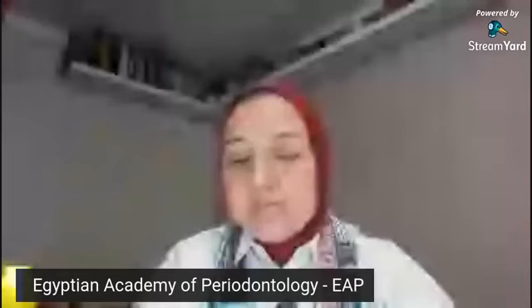So what we were saying is that after the frenotomy or the frenulum relocation, you can see that we have minimum scar formation and that we now have enough space and enough keratinized tissue, of course, to perform our aesthetic crown lengthening procedure. I don't like to do bleeding points. I like to do an exact drawing of the margin of my future gingival margin, or of the margin I'm desiring to do. So we do our markings.